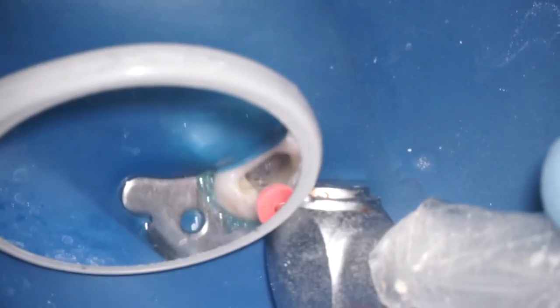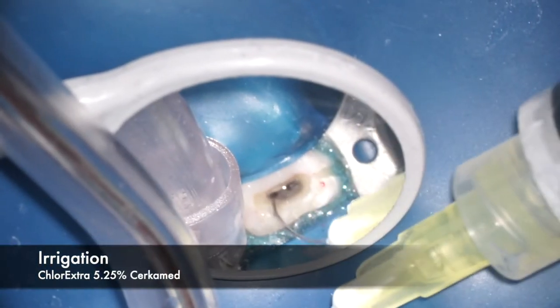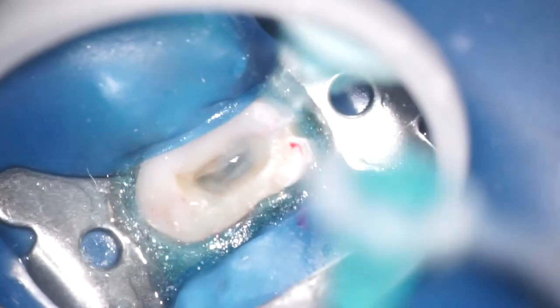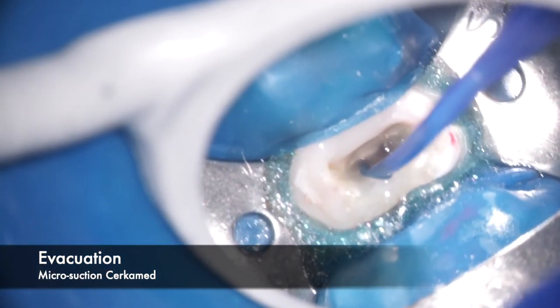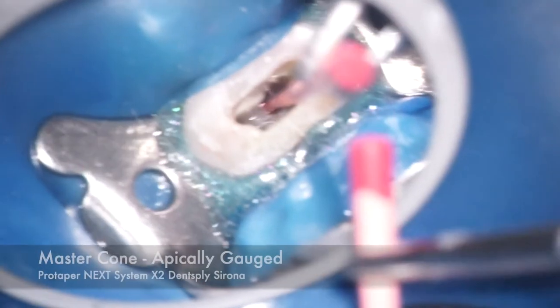After gauging, we continue our shaping process to remove possibly some small remnants of GP still along the canal walls. We also notice that both canals are joining together, and possibly that's the reason why the instrument separated in the first place — at the junction or slightly beyond it.